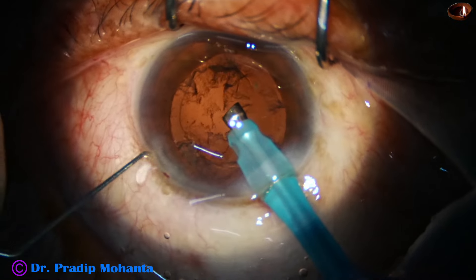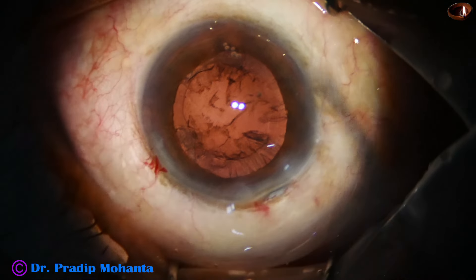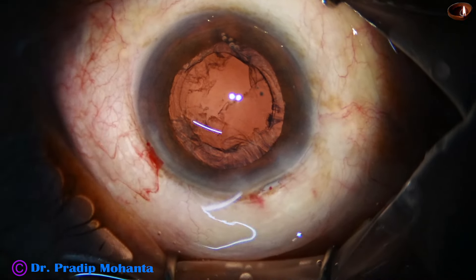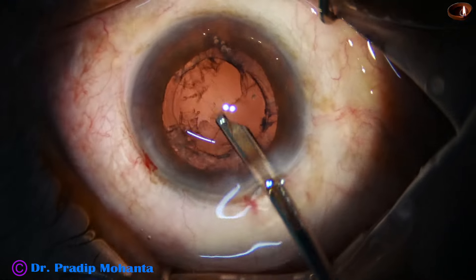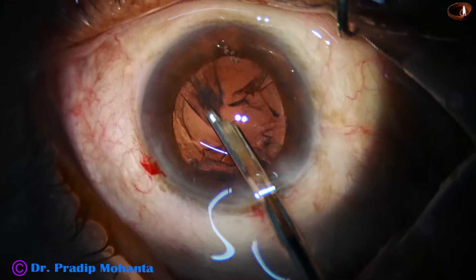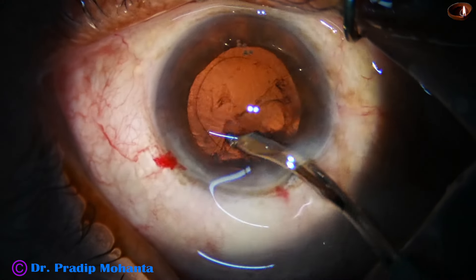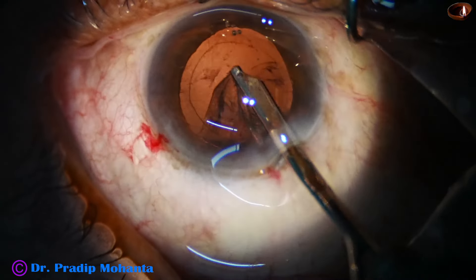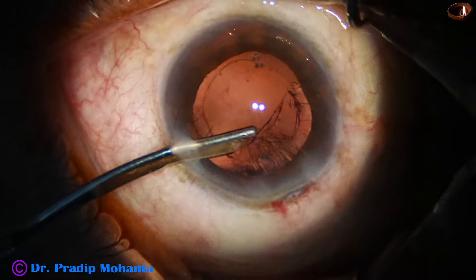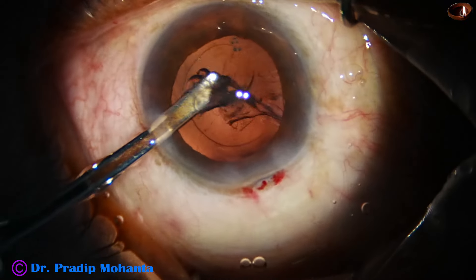In this case I did not want to remove the cortex by the handpiece itself. I come out and use a very safe instrument — the Simcoe cannula. First I fill up the anterior chamber and the bag with viscoelastic substance. The Simcoe is introduced through the main wound and cortical matter from one o'clock to seven o'clock has been removed. Cortical matter from one o'clock is also removed. I then go through the side port and remove the cortex from 12 o'clock to 10 o'clock, and then from 10 o'clock to 8 o'clock.